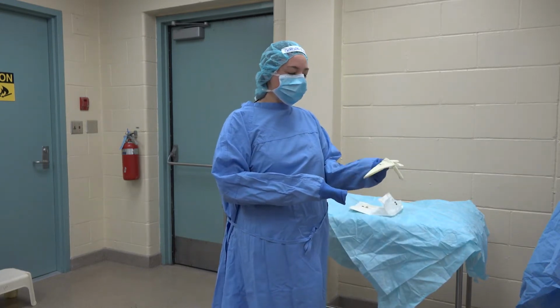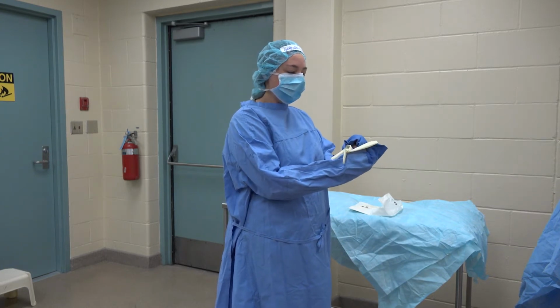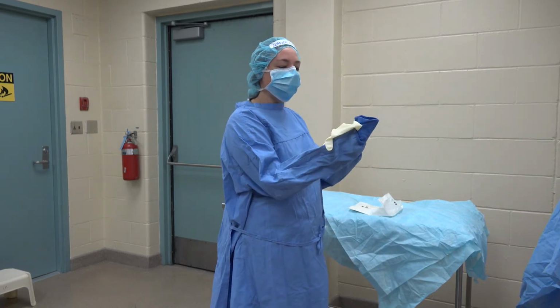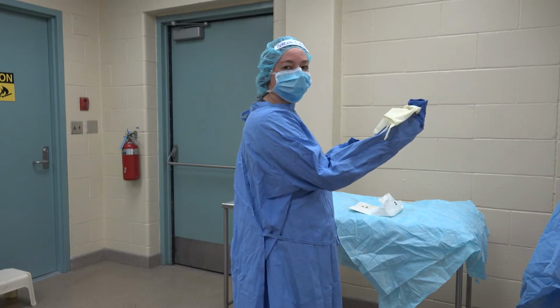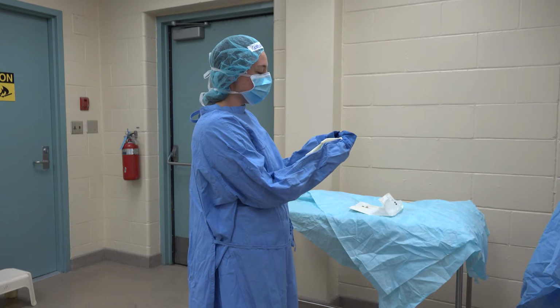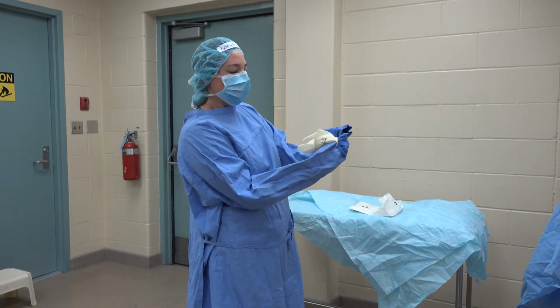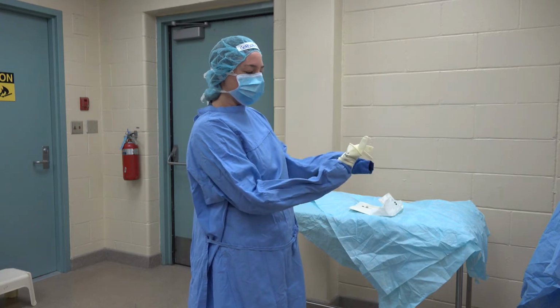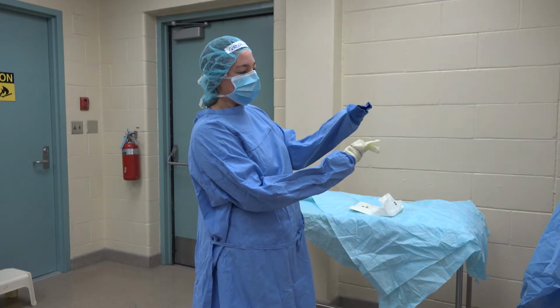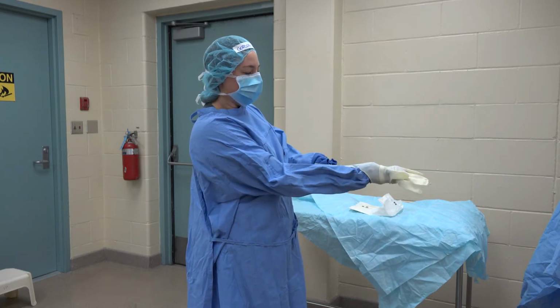So what I do is the thumb is pointing towards me. I'm going to lay it on my thumb, and I am going to hold the glove thumb to thumb, fingers pointing at me. Then I take the edge of the glove. See, I'm still holding on to it with my thumb and fingers through the sleeve, and I put it over the top of the sleeve. Okay? Then, again, still using my sleeve, not my real fingers, I'm going to pull that up.